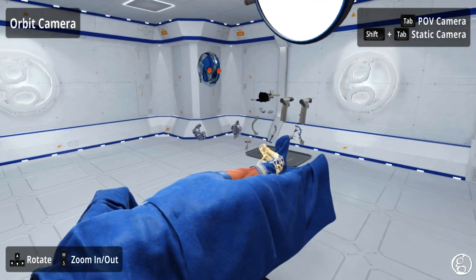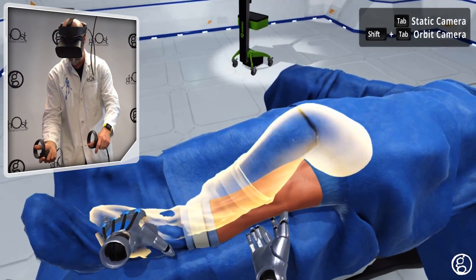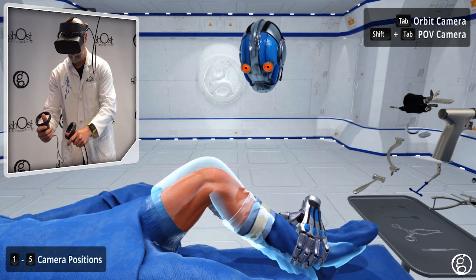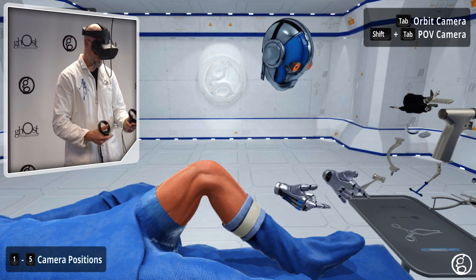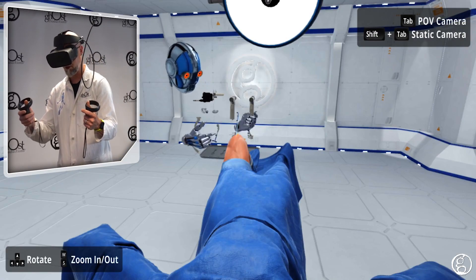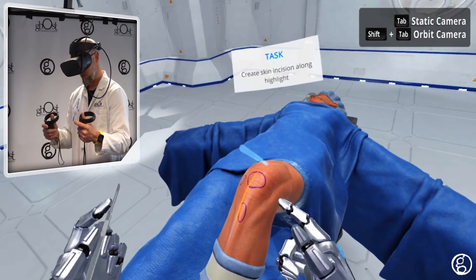The first thing I'm going to do is put the knee into 90 degrees of flexion. I'll grab the ankle here. I'm given a highlight to help me see the goal — where I want to put this leg. So now we have it at 90 degrees of flexion. I'm going to select a scalpel from the Mayo stand. I can see there's a highlight to help me know where to start my incision.